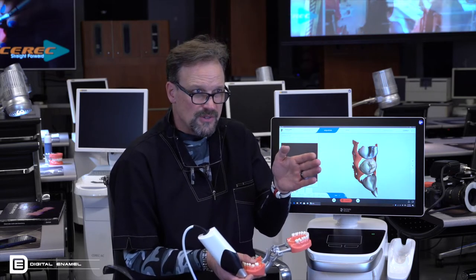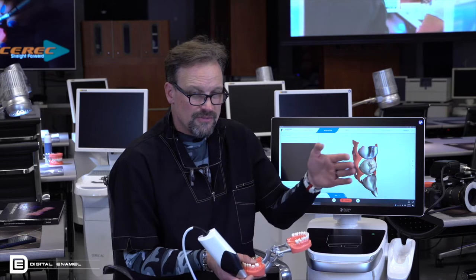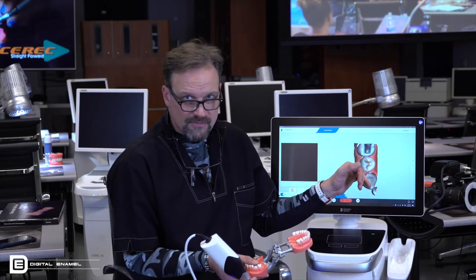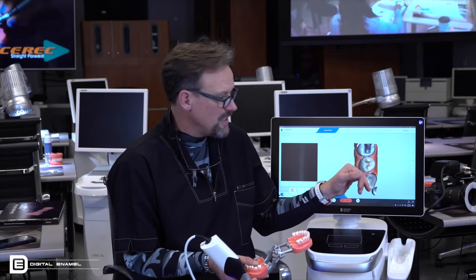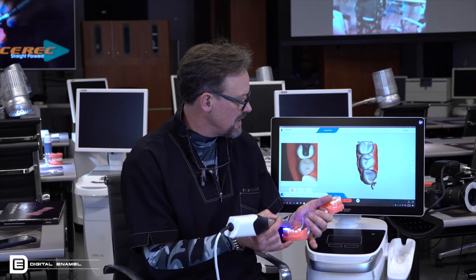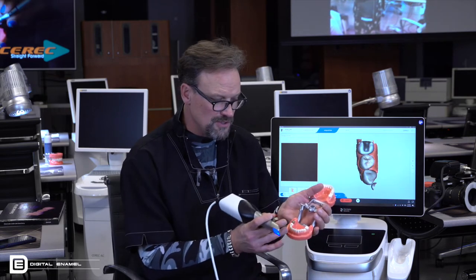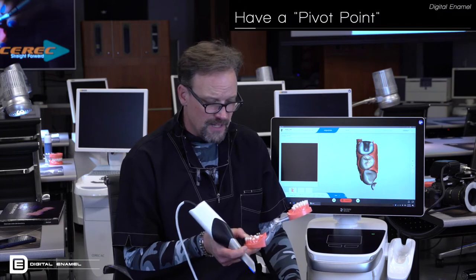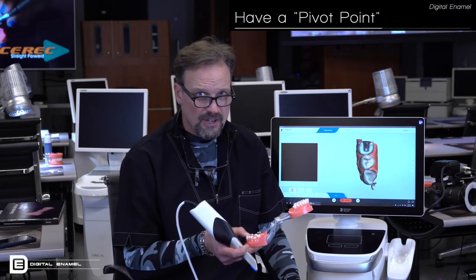And so when CEREC is trying to find out where it is in the model, like it's trying to catch up, it's always going to start looking at the beginning and then move forward. So if I show it this, which was, let's call it the first frame of the first video, watch how fast it picks up. It's going to pick up immediately and instantaneously. So it's almost like what I call a pivot point. It's good to have a pivot point on your models.